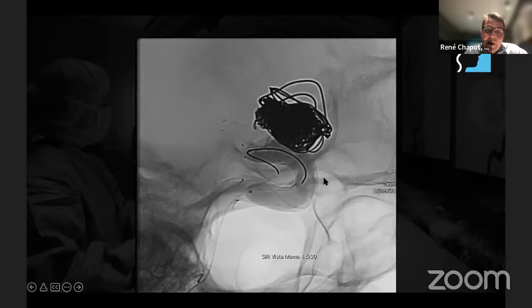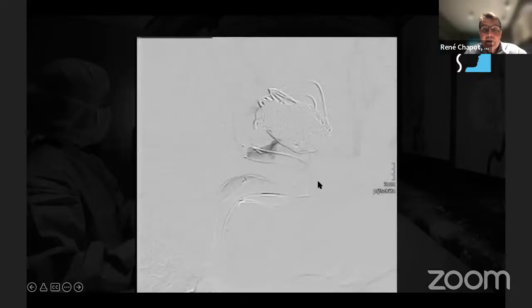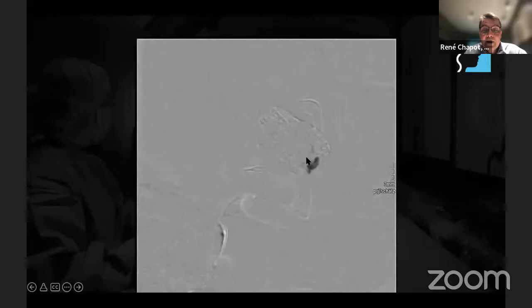So we have the first flow diverter, microcatheter in place, second flow diverter, balloon. And then we add some liquid embolic, some Onyx, which will make the flow diverters closed. You may see it here. Here is some of the Onyx that is being injected around, and it may also go to the aneurysm. It diffuses here. Of course, we made sure beforehand that when occluding here, the flow was reversed in the ophthalmic.